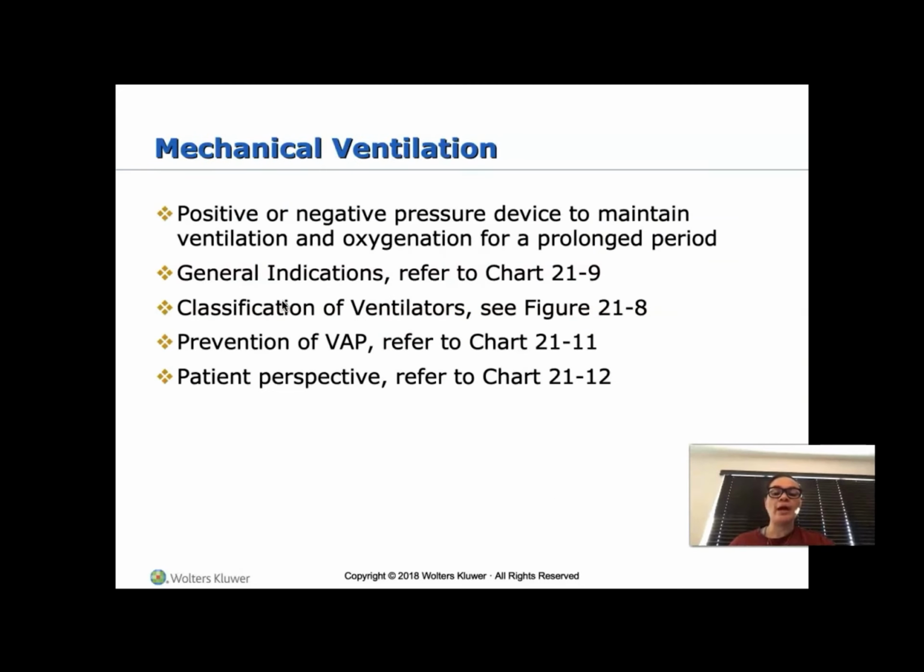So there is a variety of different mechanical vents, depending on the patient's need and why they have it. So positive or negative pressure. So that positive pressure means what? PEEP is one of those. It keeps the alveoli expanded. Negative pressure. What does that mean?